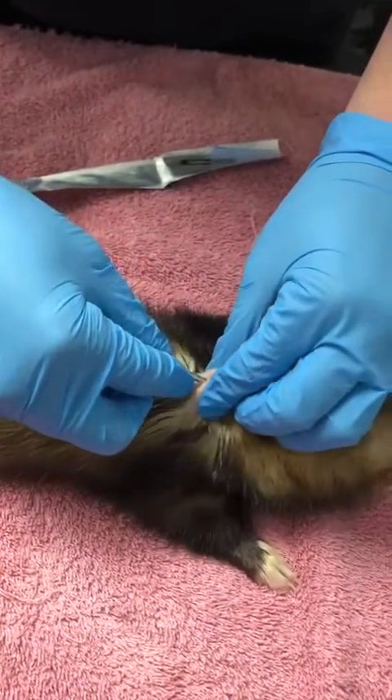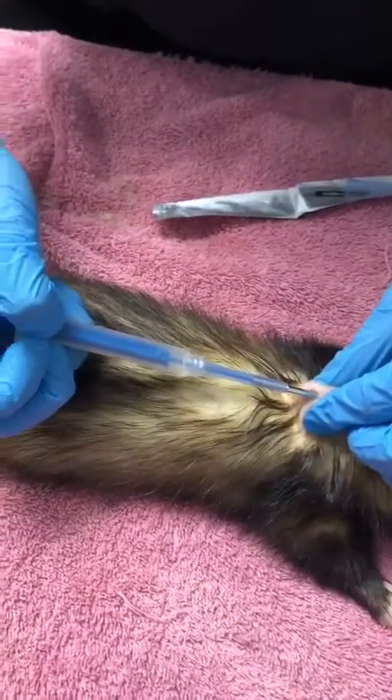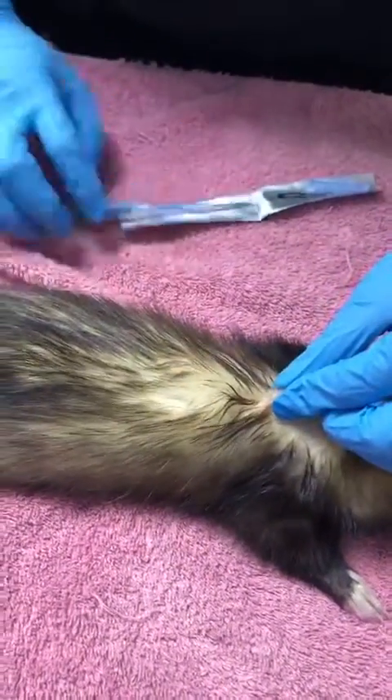It takes a little bit of wiggling to get it in. You don't have to put it in particularly far, and we can then push that implant in. Once it's in, have a little bit of pressure there.